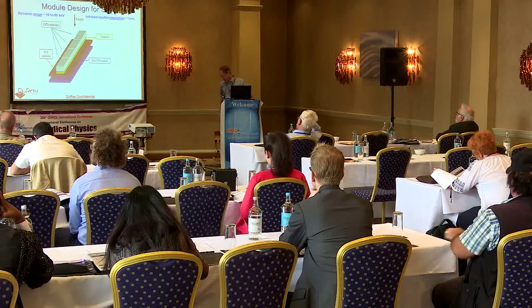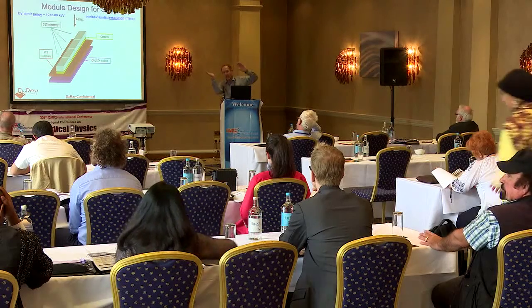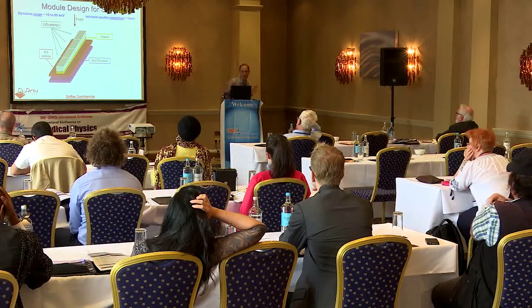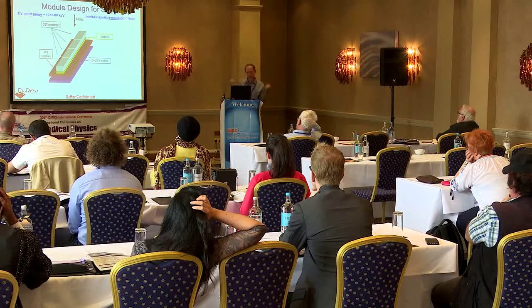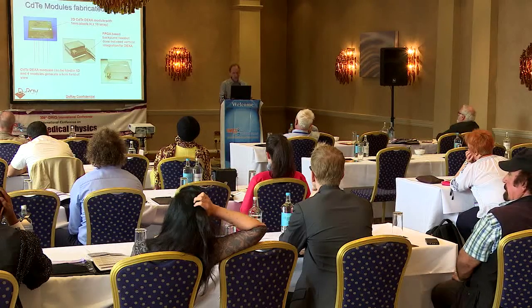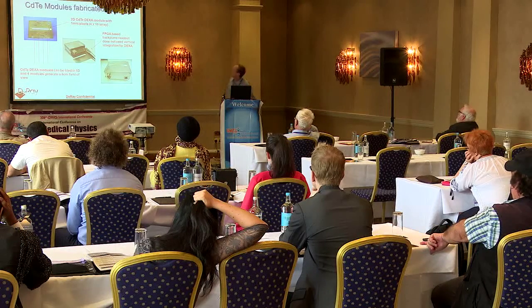Now, this is traditionally done in a dual kVp method, where two scans are done with two different tube settings and filters to create a high energy and a low energy beam, and then those two images are subtracted from each other. But if we can do the photon counting and count every individual photon and bin it into different energy bins, then all this can be done in one scan, which reduces dose for the patient, and it also reduces scan time. And so here is a picture of the detector made for spectral X-ray absorptiometry.